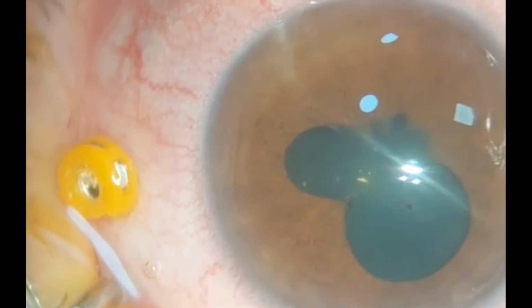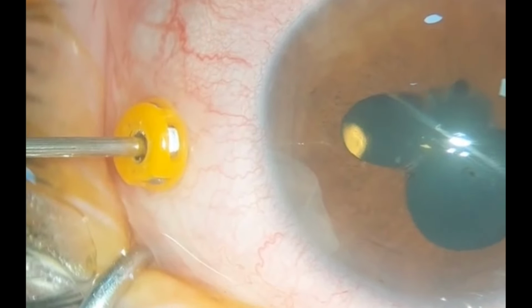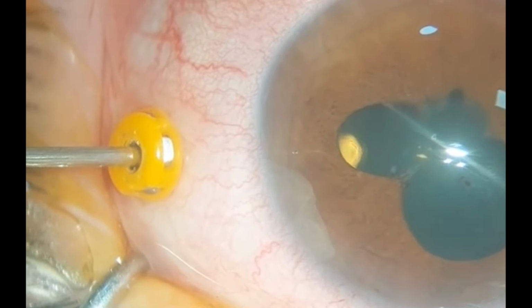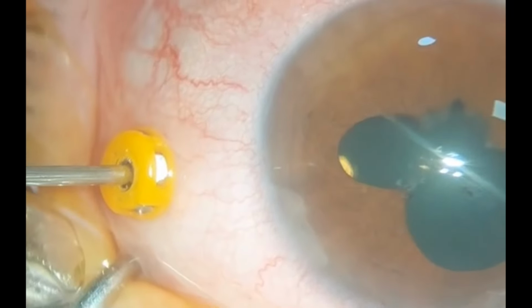At the start, the inflow is turned off to perform a dry tap, and approximately 0.5 cubic centimeters of undiluted vitreous is collected for microbiologic analysis. The inflow is then turned on to obtain diluted vitreous sampling over the lesions.